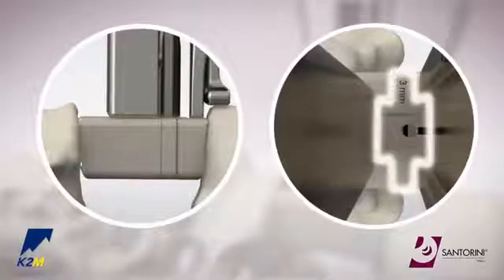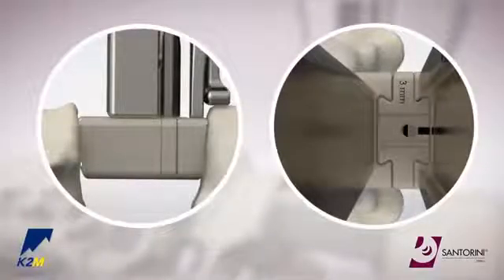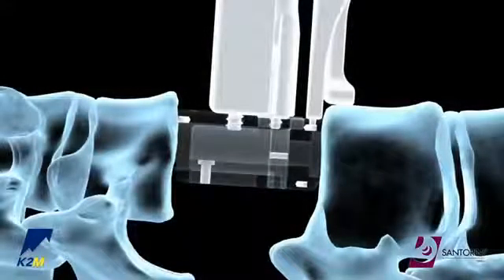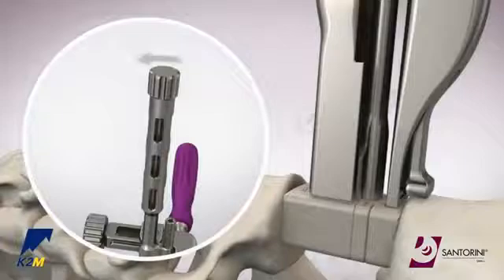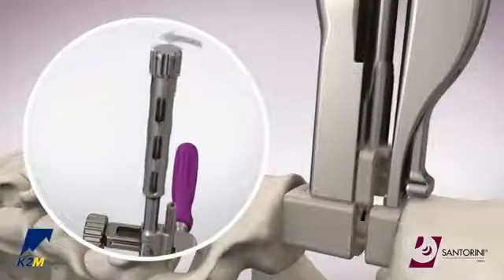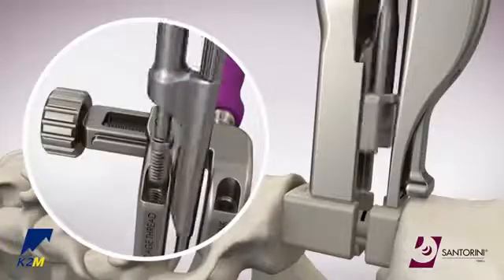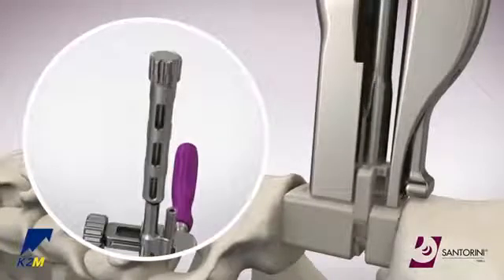Ensure there are no gaps between the clip and the dovetail on the cage. Use fluoroscopy to confirm the overall cage height. If the clip needs to be removed, simply turn the proximal knob counterclockwise to disengage the clip from the cage. Select the preferred clip size and repeat the clip insertion process.